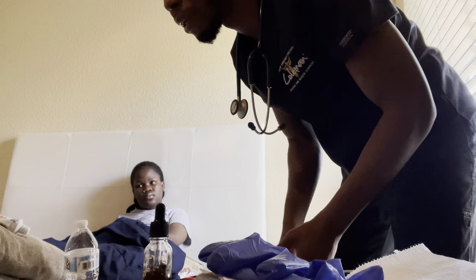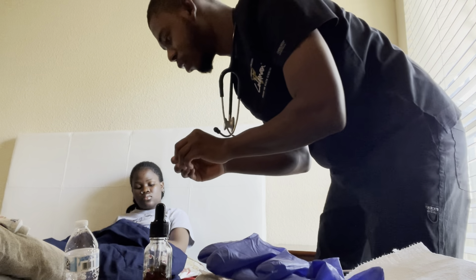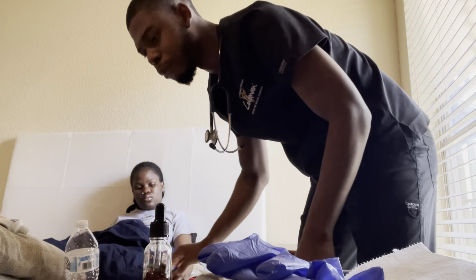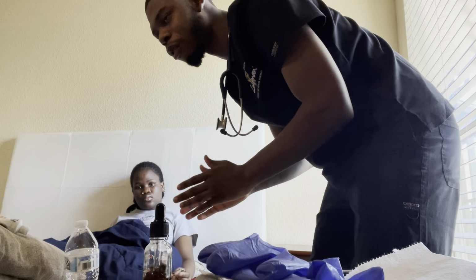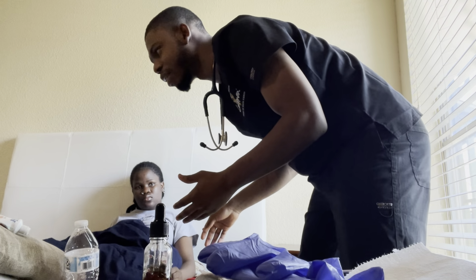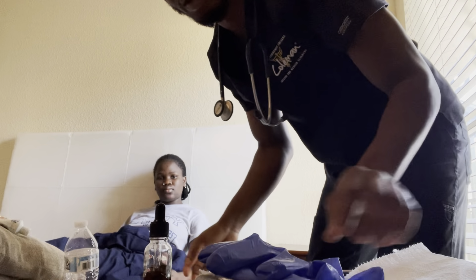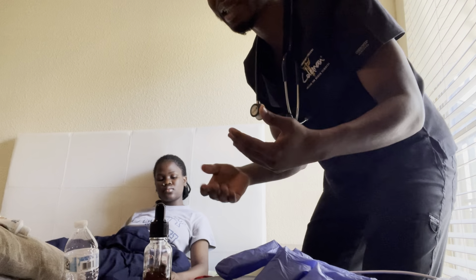Now that I've confirmed with the patient, I will apply my pulse oximeter in order to monitor the patient oxygen saturation level. When I'm done applying the pulse oximeter, I will put the patient in a comfortable sitting position, or I will place the patient in a semi-Fowler position. Thank you.